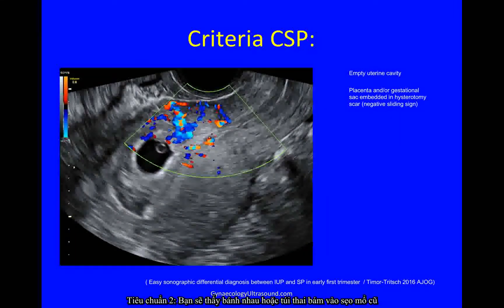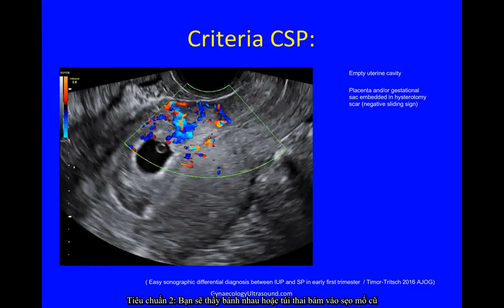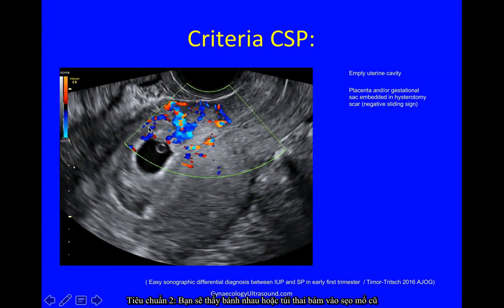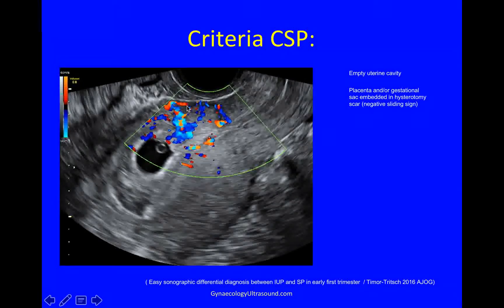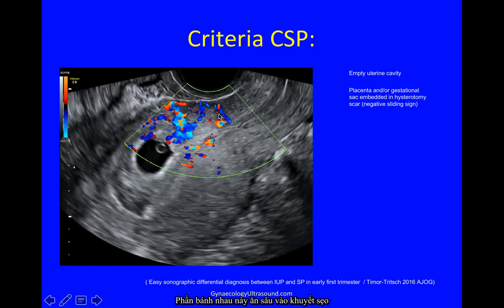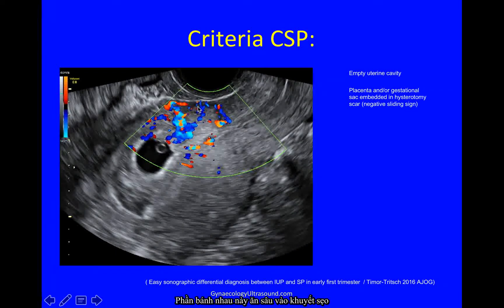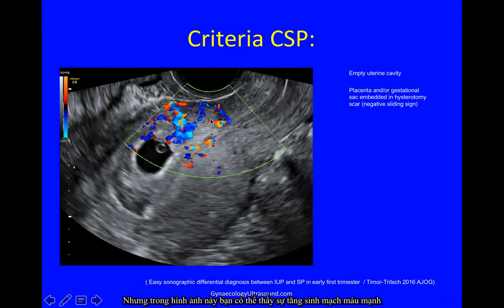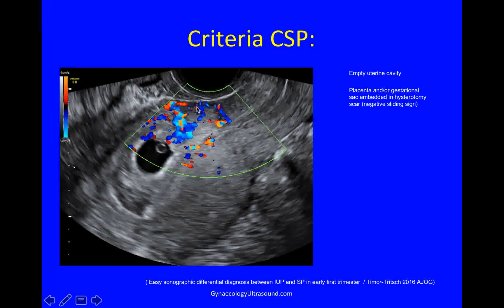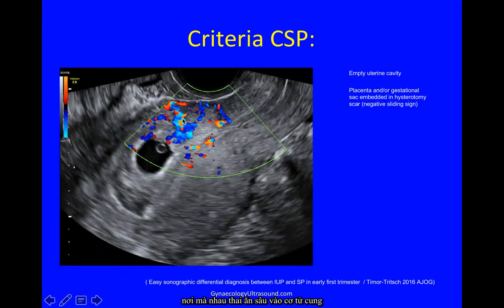The placenta or gestational sac should be embedded in the hysterotomy scar. This is trophoblast embedded deeply into a niche. I can't show you the negative sliding sign in this still image, but you can see strong vascularity where the trophoblast is actually invading the myometrium.